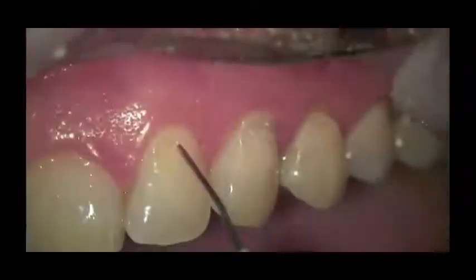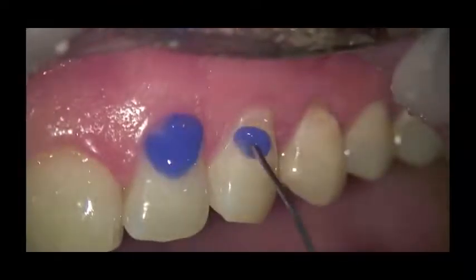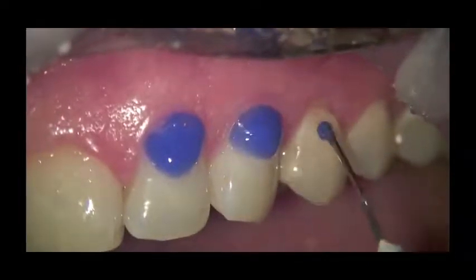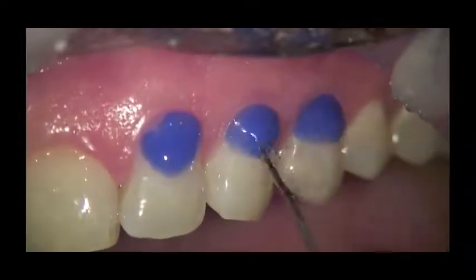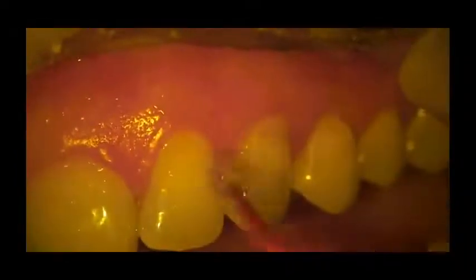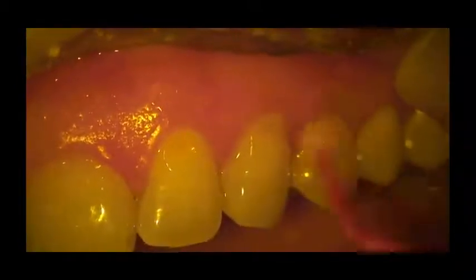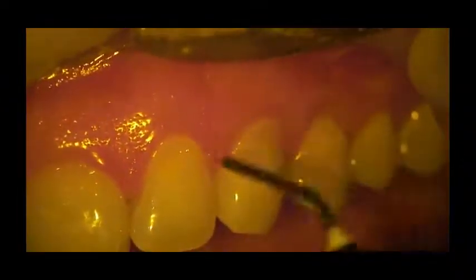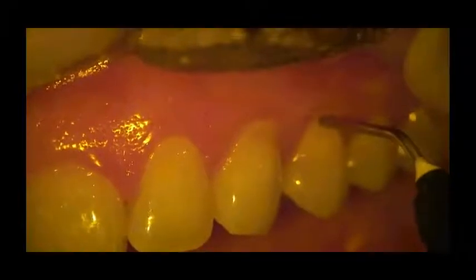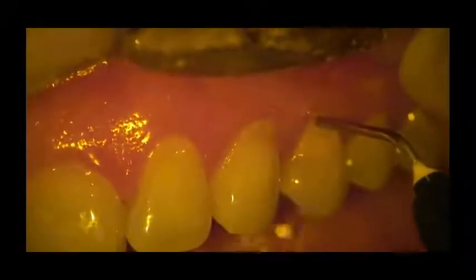Now we're going to use a total etch technique. I generally always use total etch technique with these restorations. And I'm etching the surface. And I've edited this so it's a little quicker, but here's the Single Bond, 3M Single Bond. We're going to follow our manufacturer's directions with the application of our bonding system. Again, that was edited, so it was quicker than if you watched me do it live.